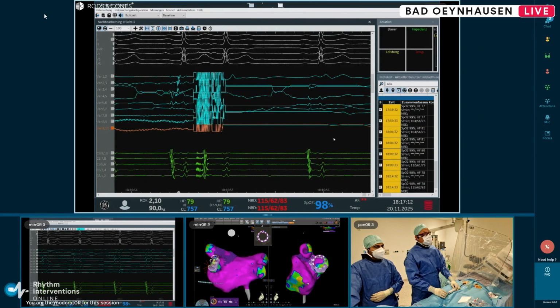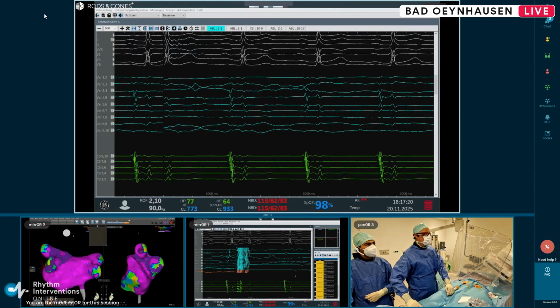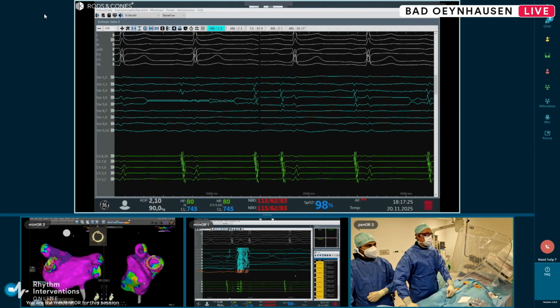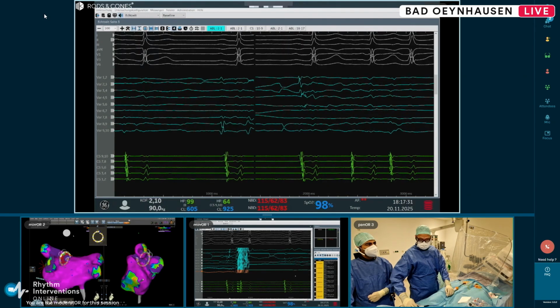But anyway, again, as Richard said, we will rotate the catheter, we will close the gaps. And again, the color coding will definitely help us with that. And the catheter comes back. We see red shows us here was already a good place for ablation. So we need to angulate the catheter a little bit. Now here comes more green, but we are dropping out.